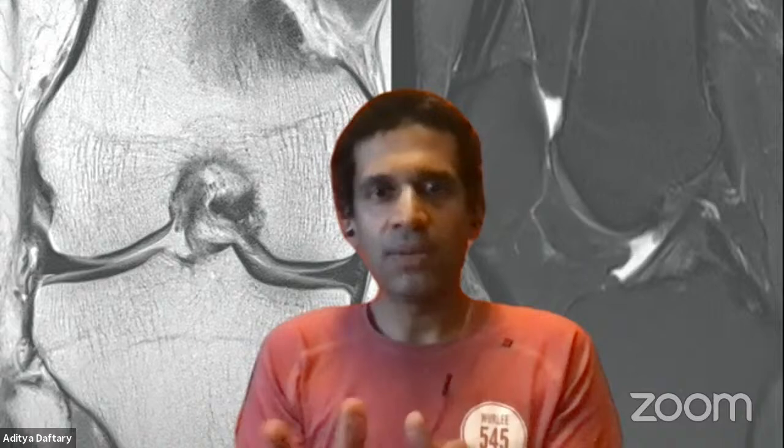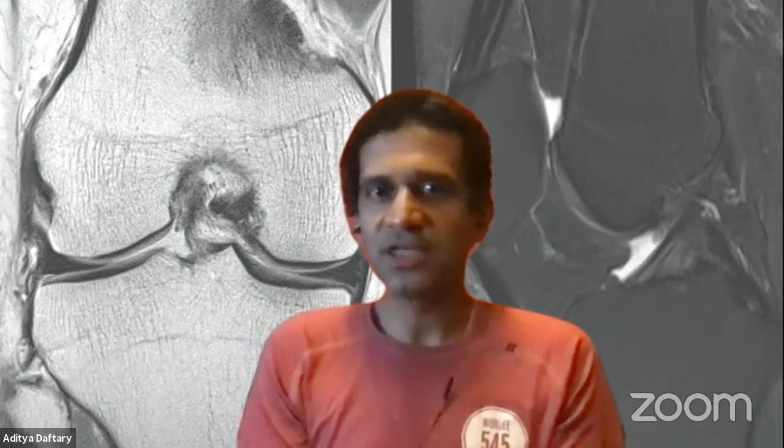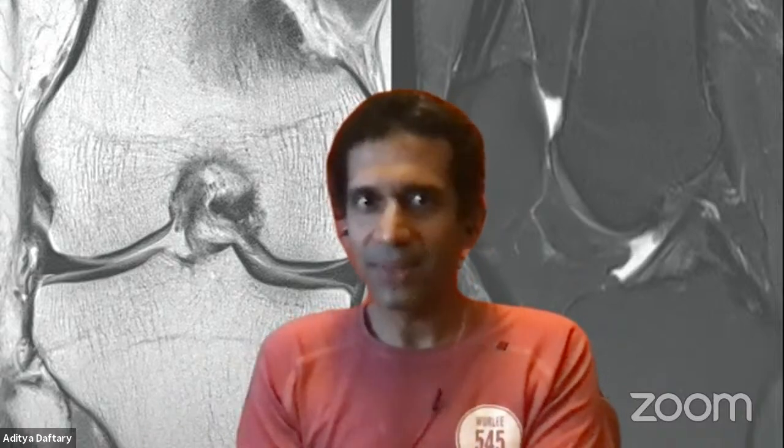Then we will start talking about some of the common abnormalities we see, such as bone marrow edema and fluid. Then we will talk about the meniscus, and last we will talk about the ACL. Sajeer will show some cases in between, and then we'll discuss some common clinical conundrums we come across. We don't want to get into too much detail on cartilage, patellofemoral and other areas. We will leave that for a different session. That way it gives us enough time to address all the issues that come up in these three large areas.